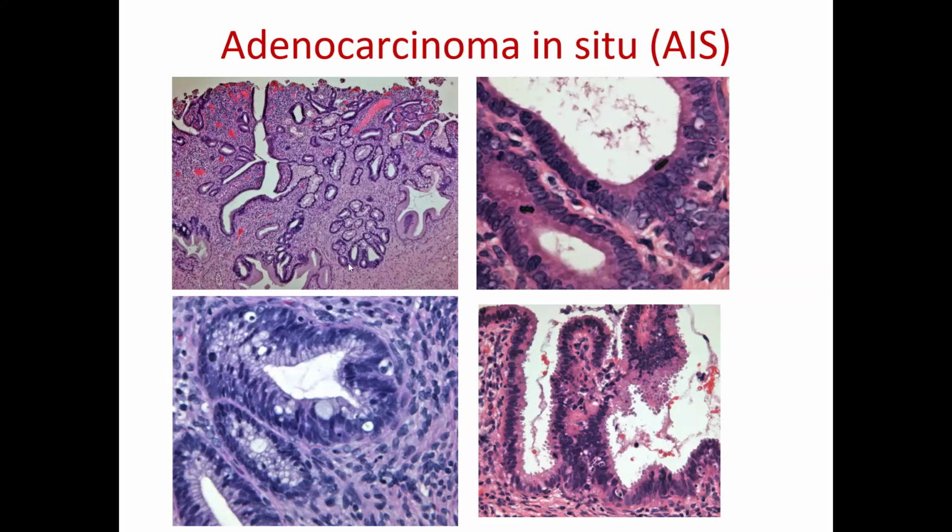Something about AIS as well: typically the dysplastic cells sometimes don't involve the entire gland. They involve only one side of the gland. The other side is not involved. And even when they involve the entire gland, some of the glands within the lobule are involved while other glands are not. Look at this appearance here. You see some of the glands up here have these features: crowding, mitosis, apoptosis. But down here you maintain the lobular architecture and it does not involve the entire circumference.